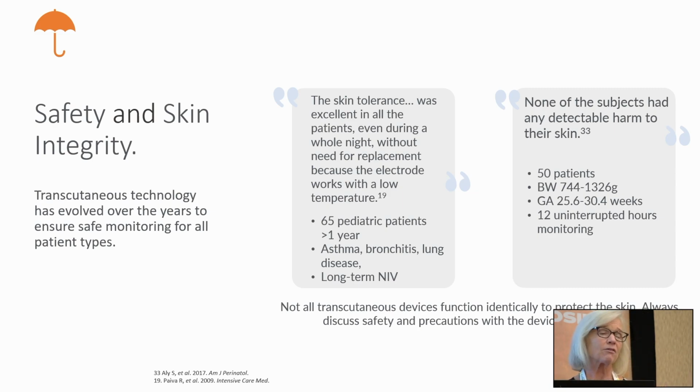The sensor itself does need to be calibrated on a regular basis. It's like a blood gas machine, so it is recommended to calibrate it every 8 hours. You take it off, assess the site, make sure the site looks good. If the site looks good, you can go back to that same site for up to 24 hours. In between those calibrations, you can just return to that same site. We've got a couple of skin integrity studies here that looked at pediatric and neonatal patients, and they monitored for 12 hours without any detectable skin harm.